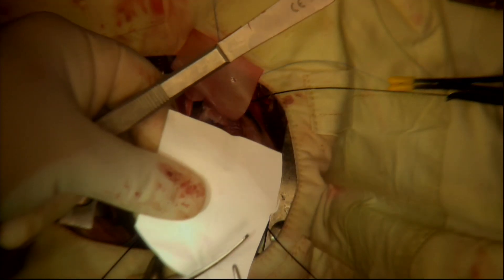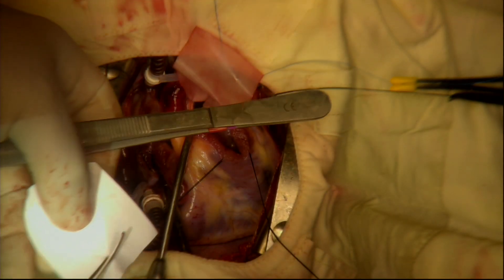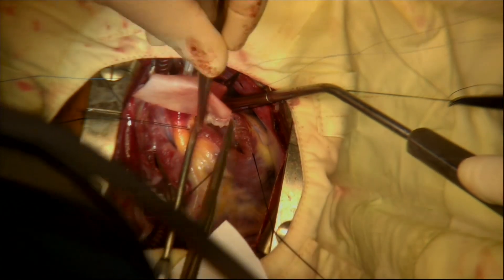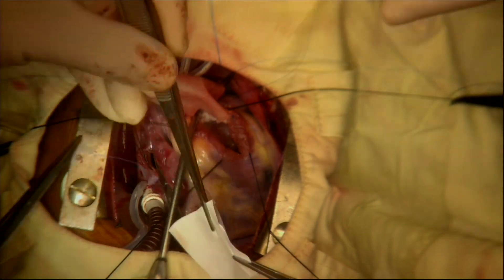A small sheet of Gore-Tex membrane is cut to the correct size and shape to be incorporated into the repair as a unicuspid pulmonary valve. The Gore-Tex membrane is then sewn into the repair, incorporating it into the augmentation patch as a unicuspid pulmonary valve.